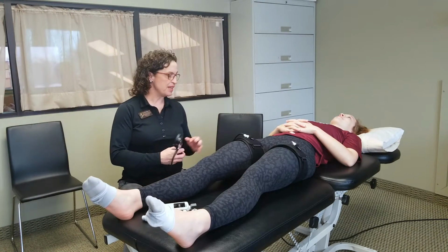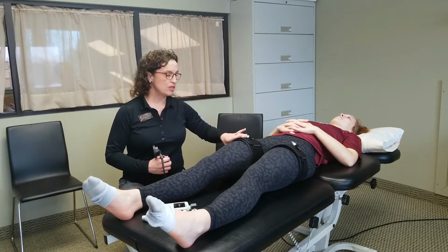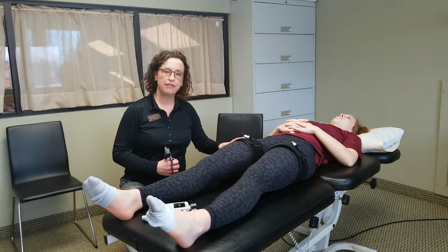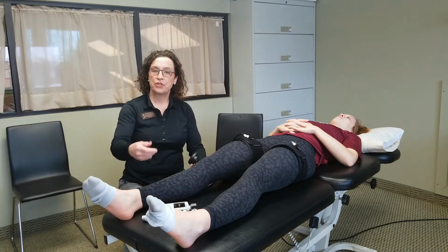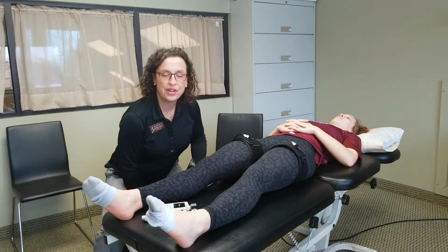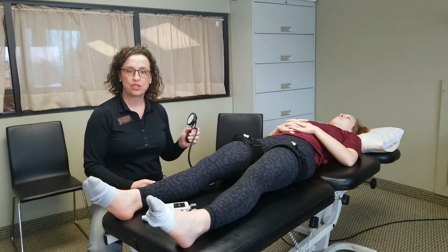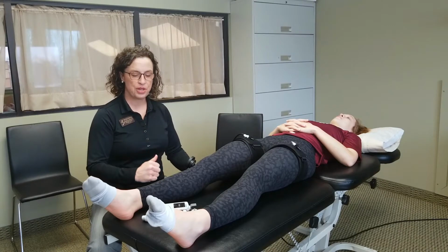So you can see she's been wrapped in these blood pressure cuffs in her upper thighs. And you could certainly do this in the upper body as well, around the upper arms with a different size cuff. And then I've got a blood pressure device which I'm going to pump up. I'm first going to start by finding out what her 100% occlusion pressure is, and then we'll do some calculations and exercise at a lower pressure today.